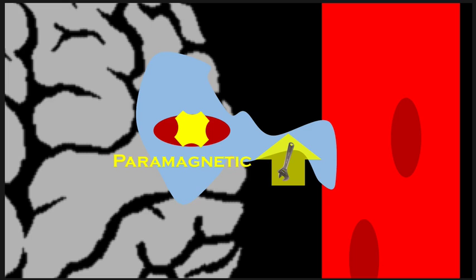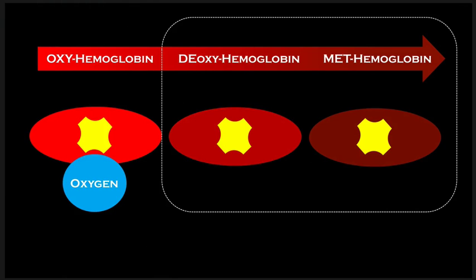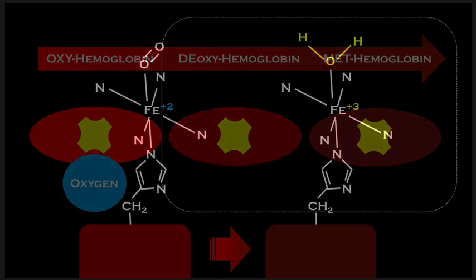Now the T1 signal is going to be the same in both hyperacute and acute stages. So this is what he considered the acute stage. Now the next thing that's going to happen is there's going to be a continued breakdown of the blood product. So we're going to change from deoxygenated hemoglobin to methemoglobin. Now, methemoglobin has 5 unpaired electrons, and that is going to mean that it's even more strongly paramagnetic. I drew the color changing here, but let's take a more in-depth look.